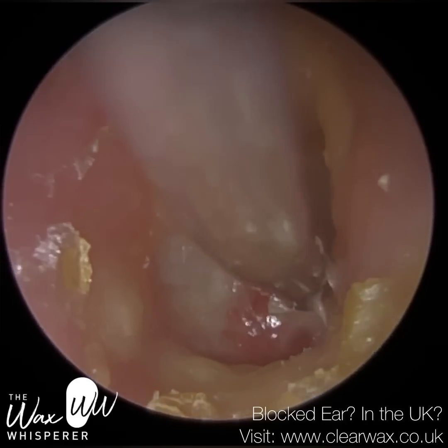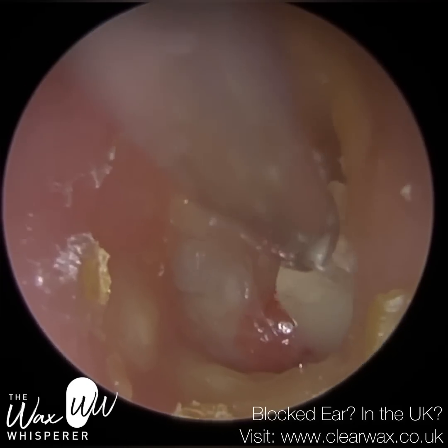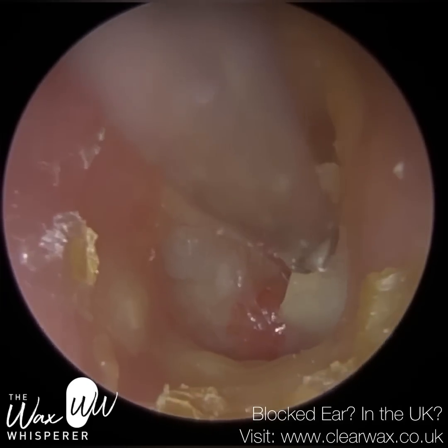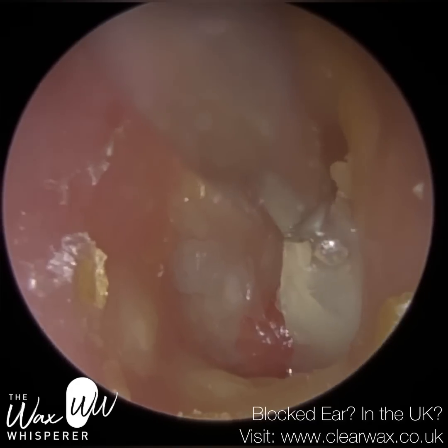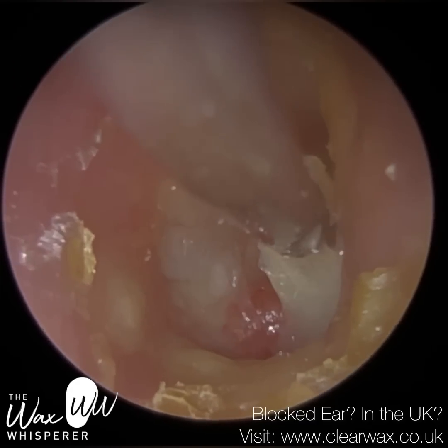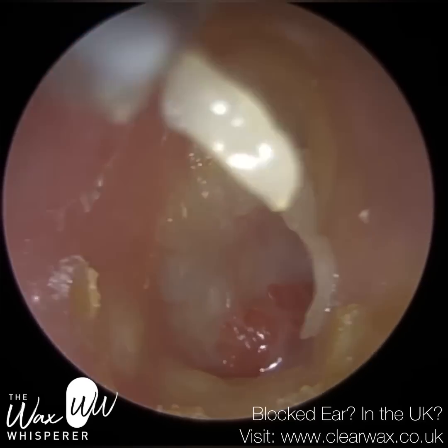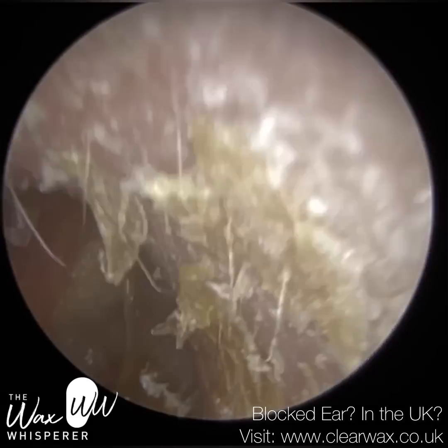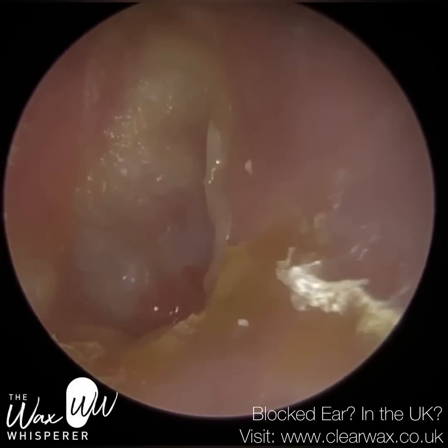And I've had to just, as I said, bend the tip of the fine end to get access. Otherwise, I'd make contact with the front part of the ear canal. You can see I'm pretty close to it, even with the tip of the fine end being angled. But we want to avoid that because it is very sensitive. And I know firsthand because I've had that part of my ear poked before, and it was not very nice and not very comfortable. So just got a piece out there. It's going to go back in to extract the rest.